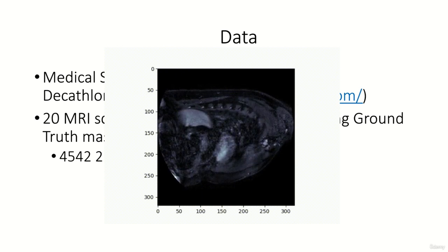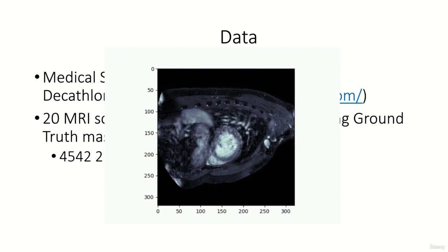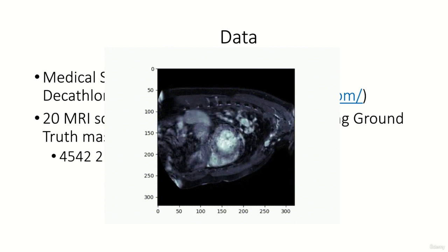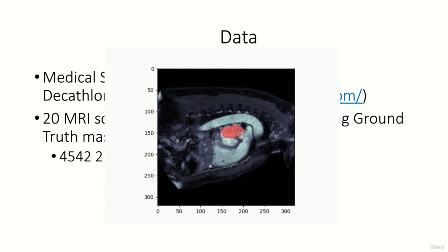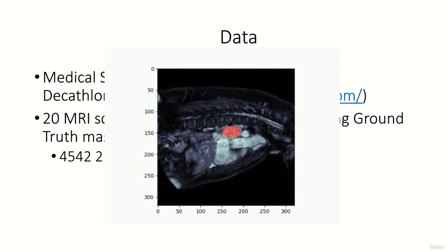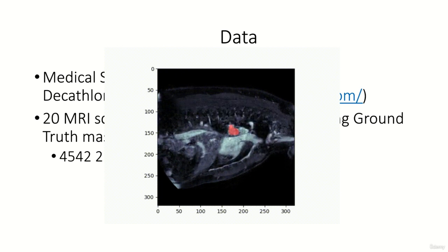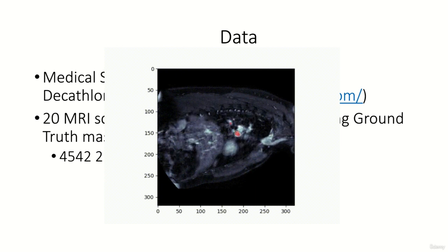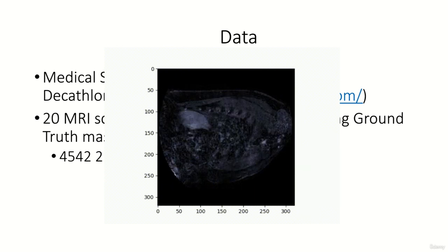As the y-axis in the sagittal orientation moves from posterior to anterior, or from back to front, the top rows of the image visualize the back of the patient. In contrast, the x-axis slices from inferior to superior, or from bottom to top. Therefore, the left columns visualize the stomach and the right ones the neck.